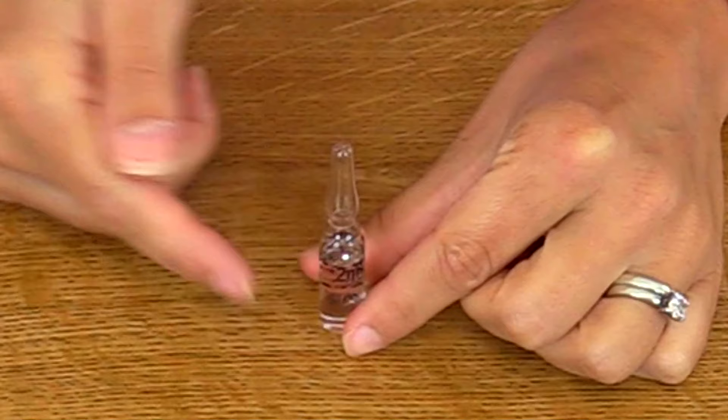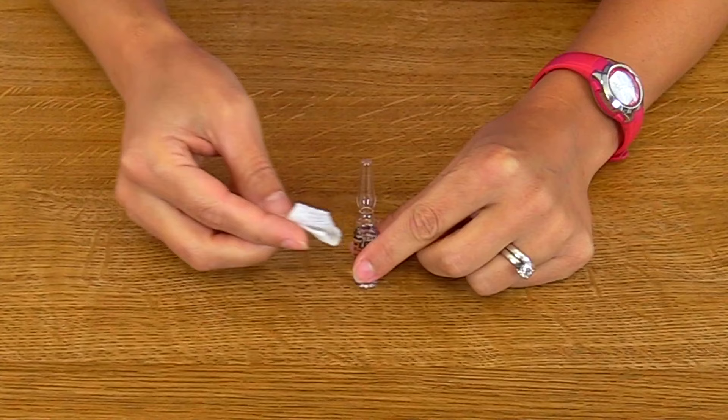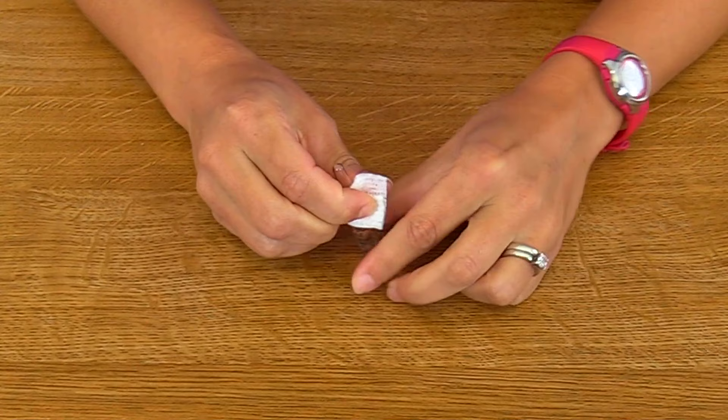Then take your alcohol prep and clean the neck of the ampule to help prevent contamination whenever you go to break it. Clean it and then let it completely dry.